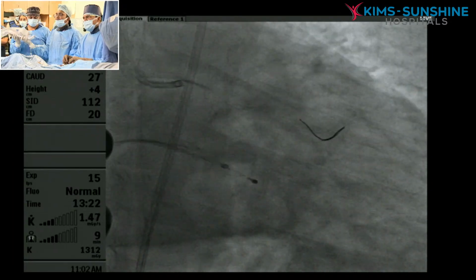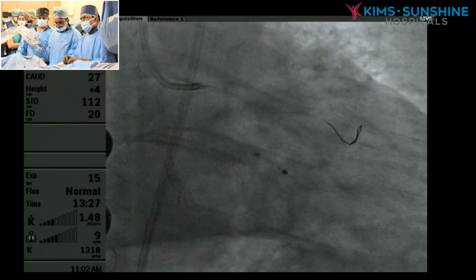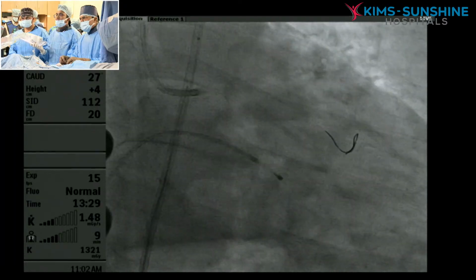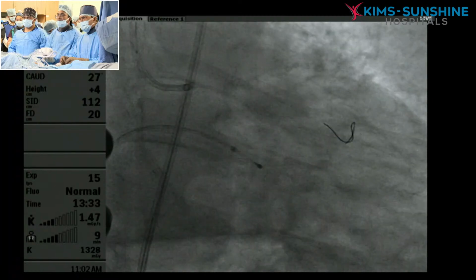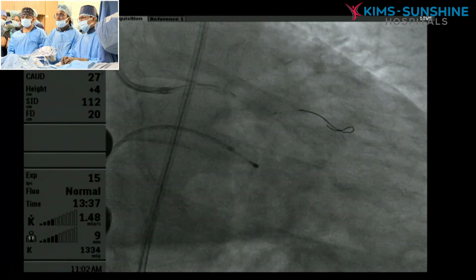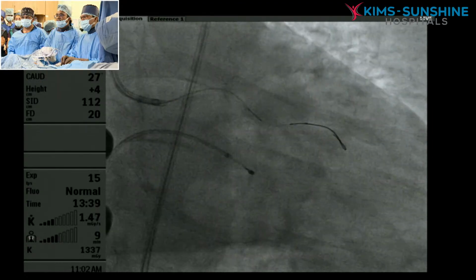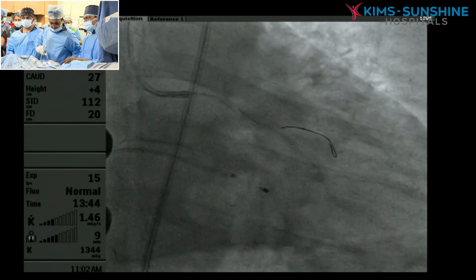The angiogram didn't show any slow flow or no flow, and a reasonably well dilated L6 area. That's the reason we deferred the further Rota steps. Then we exchanged the catheter with the run through, this one. Yes, sir. Here onwards we will see. That's enough.